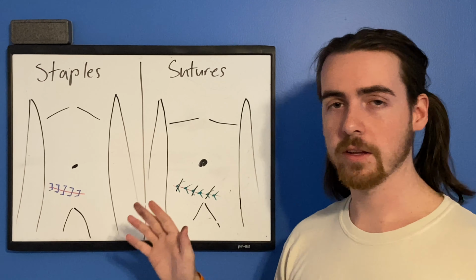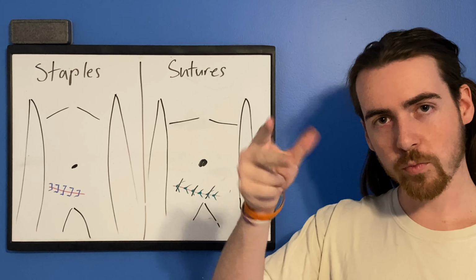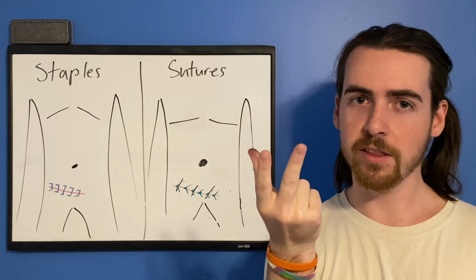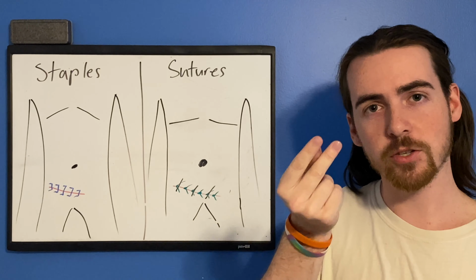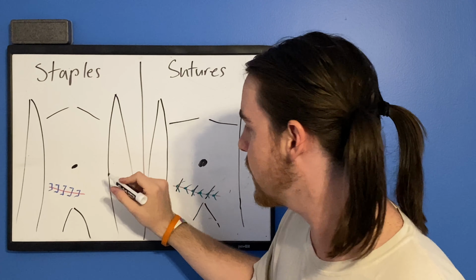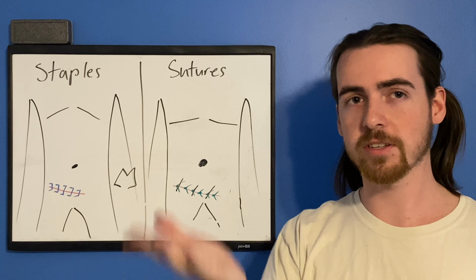Staples, on the other hand, are a little bit simpler. If you've gotten to use the tool in lab, it looks like a pair of tweezers with 3 prongs. You're going to use the 2 underneath and then the 1 up top. So the idea is you go underneath the staple with the 2 prongs, and as you begin to close the tweezers from the top, it will push the middle of that staple downward and pull the outsides up to make sort of a shape that looks like that, like an M. And it will open up the staple and you can safely lift it out of the skin.